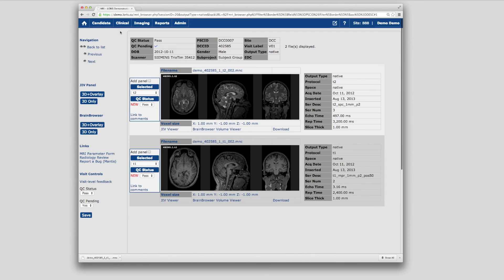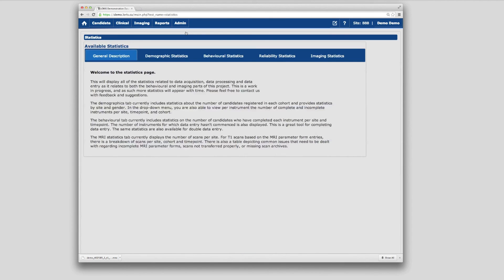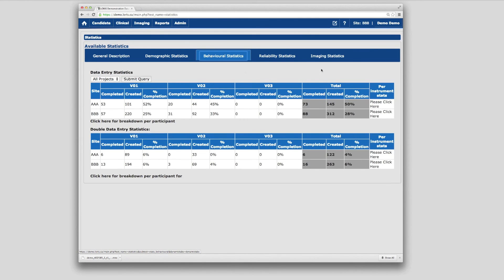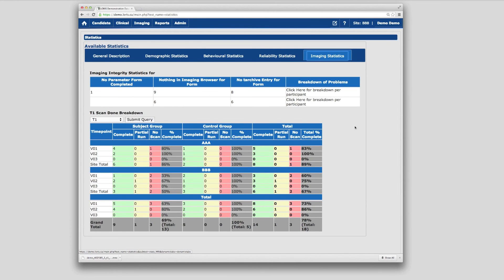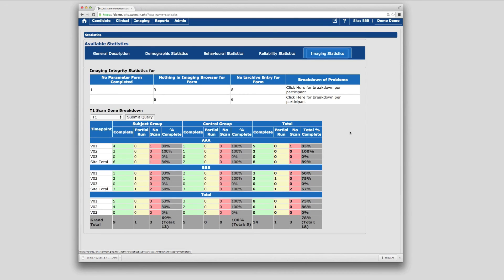LORUS has many project management tools for at-a-glance status reporting and monitoring the flow of data in your study. One of the key tools for tracking the progress of imaging data acquisition is the imaging statistics page within the database statistics module, located under the Reports menu. Various statistics sub-modules exist for demographic, behavioral, and other categories of data. The imaging statistics tab gives a bird's-eye view of how many scans were collected, loaded into LORUS, and passed QC — important for rapid identification of any missing or poor quality data sets.